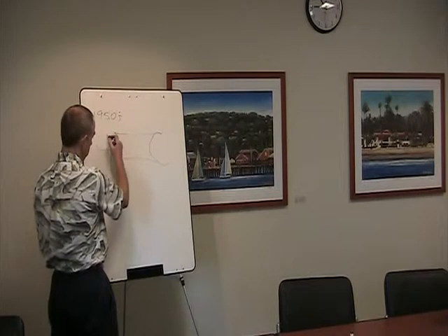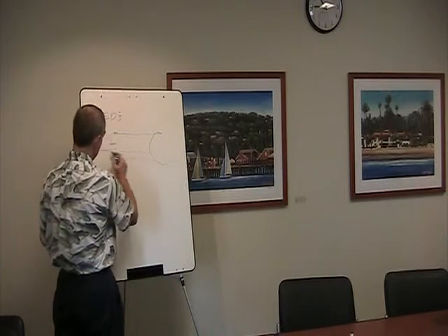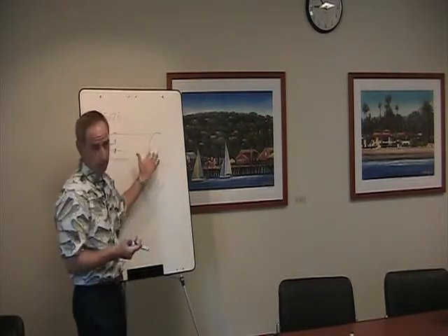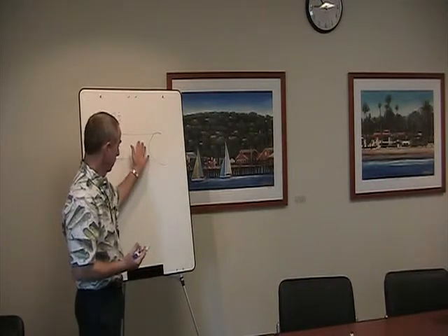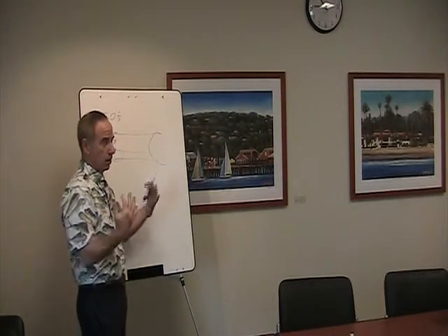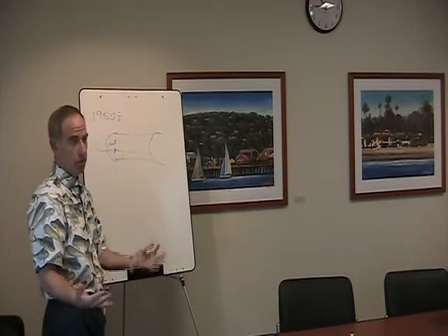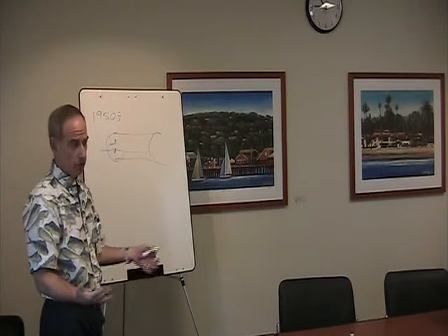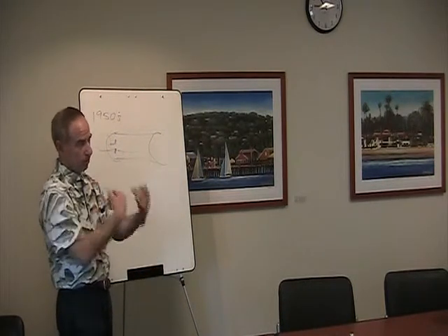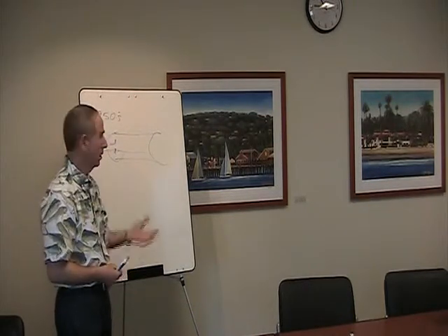The patient would be laying inside this big cylindrical device on a platform, and there would be a rubber collar around the neck so that there was a seal. Essentially, it was a vacuum type device. So the pump would create a negative pressure within this cylindrical tank, and that would allow the pleural pressure to become negative, and you would breathe just like you normally breathe, right? That's how you breathe with your diaphragm: the diaphragm descends and creates a negative intrapleural pressure. Air rushes in because of the gradient between the ambient pressure and the negative pressure in the chest, right? Same thing happened here.